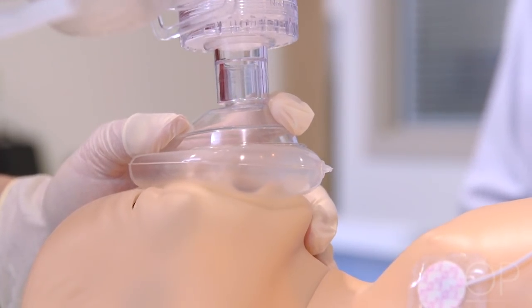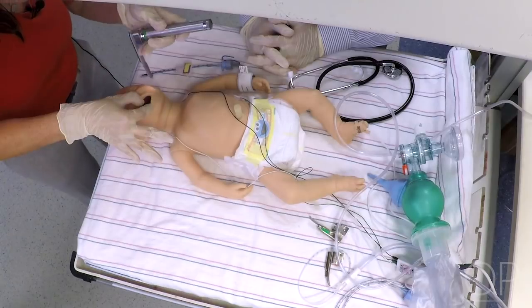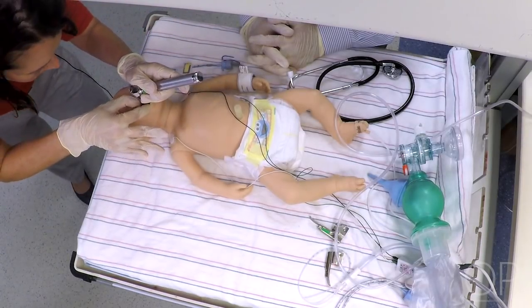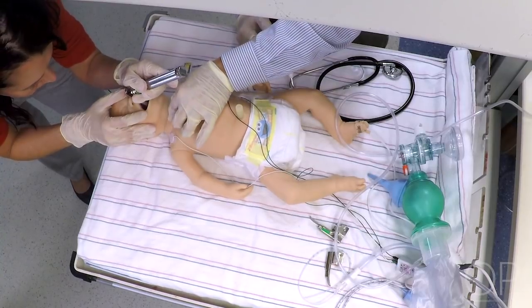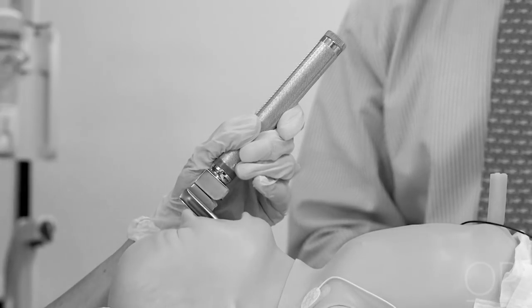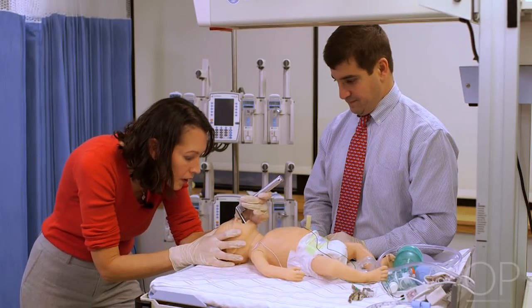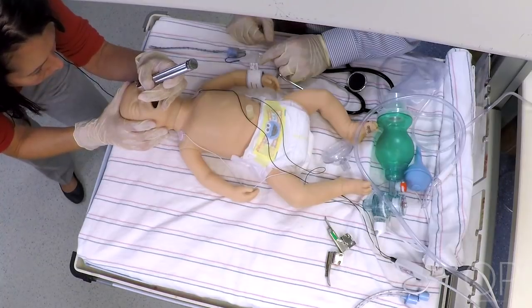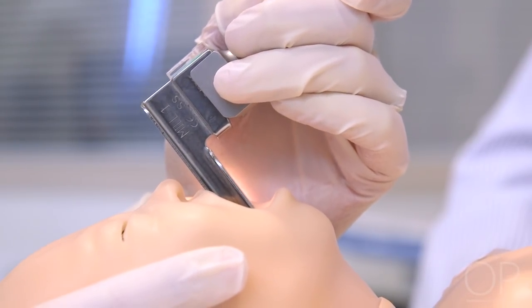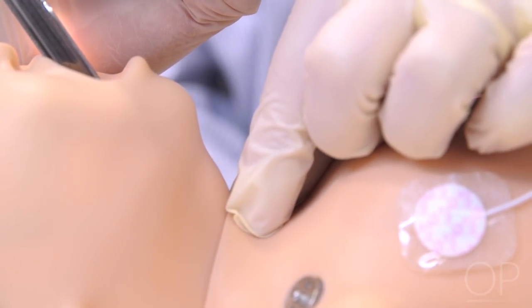Preoxygenation should be performed according to the area of practice and patient population. Appropriate technique should be applied to open the mouth prior to inserting the blade. The blade should be smoothly inserted using the left hand to hold the laryngoscope handle. The laryngoscope handle should be lifted forward to obtain a view of the vocal cords. Take care not to rock the handle and blade or press against the gums or teeth if present. The intubator should position themselves to optimize visualization, and providers may choose to apply a gentle downward pressure externally to the glottis to improve visualization of the vocal cords.